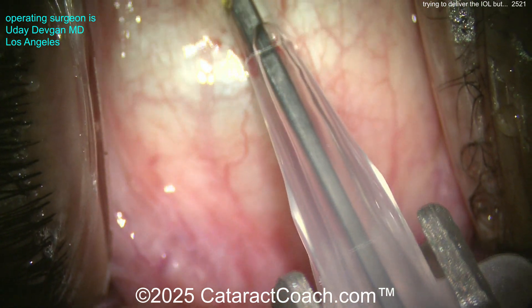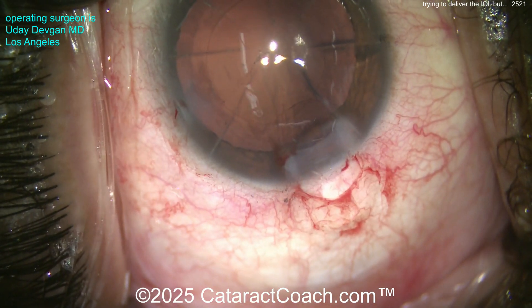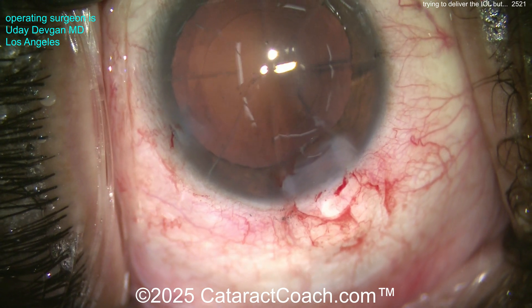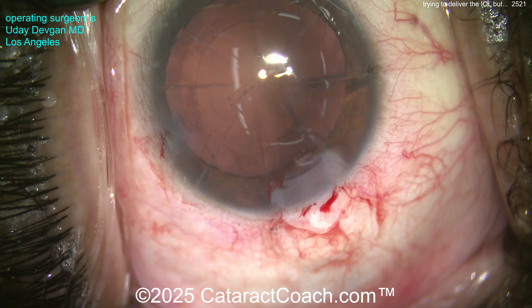As we deliver it, look — we're trying a wound assist here, getting the eye back in primary position. But it just won't go in; it's too tight of an incision. So what I'm going to do, instead of trying to shove it — I don't want to rip those RK cuts. Think about it, that would be a hot mess.